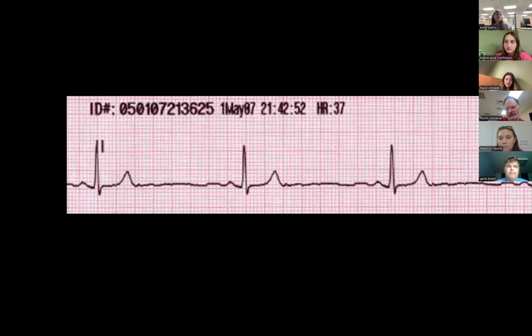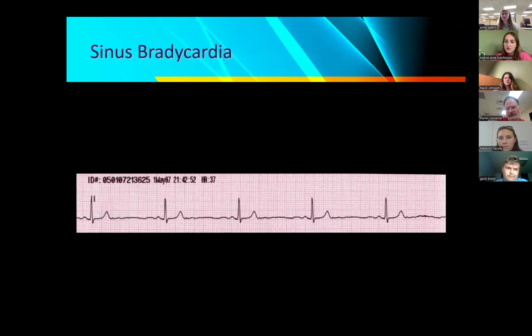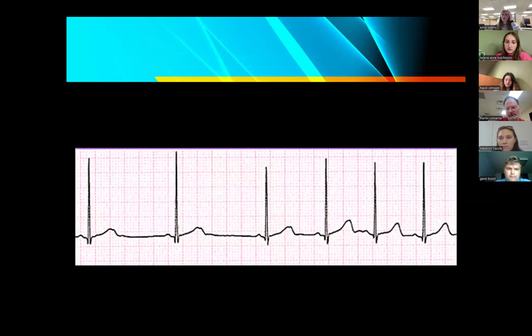Gavin, this one's going to be yours. Rate. Maybe 60. Excellent. Rhythm. Irregular? Absolutely. Now, Gavin, remember, if we say a rhythm is irregular, now we've got to answer our next question.